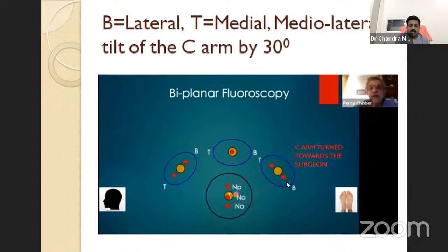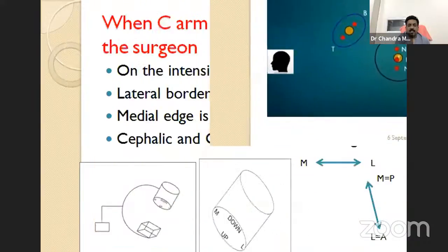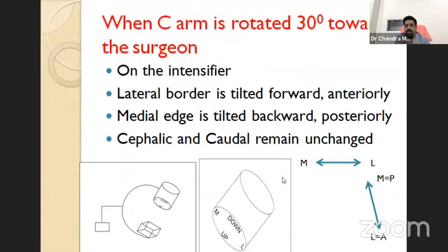Go to the previous slide, sir. This is a very, very important slide. When you are tilting, lateral has gone anteriorly. Very beautiful slide. I did not know about this previously. I have done thousands of PCNL, but this is a more scientific way of remembering the needle in relation to the calyx. If your needle is more anterior, you will interpret it as lateral to this calyx or stone. Please remember this slide and take a picture if you are a beginner. It will help a lot later on.